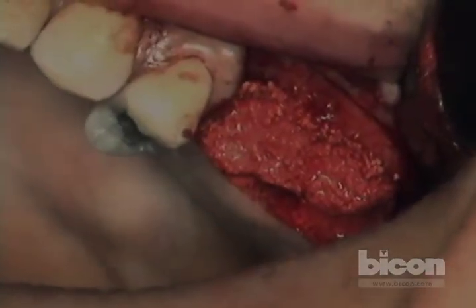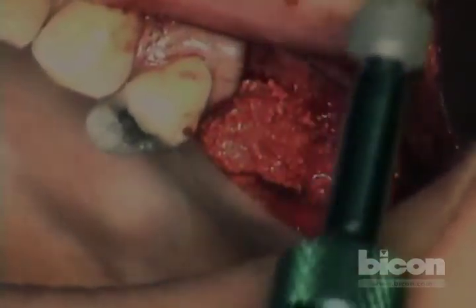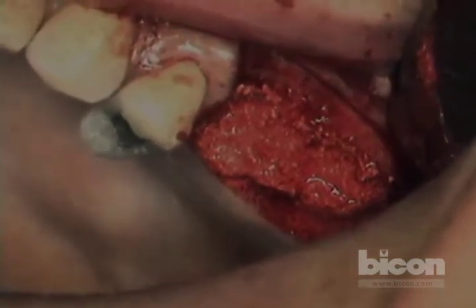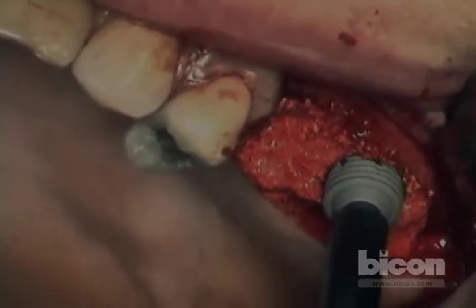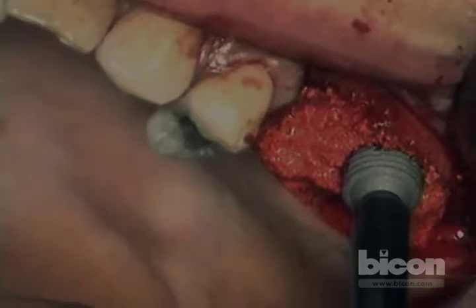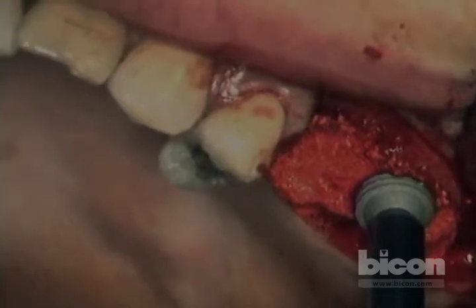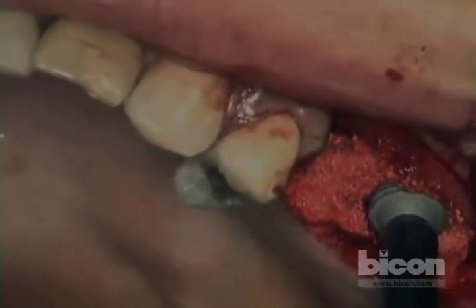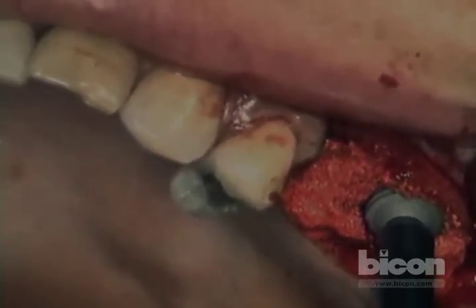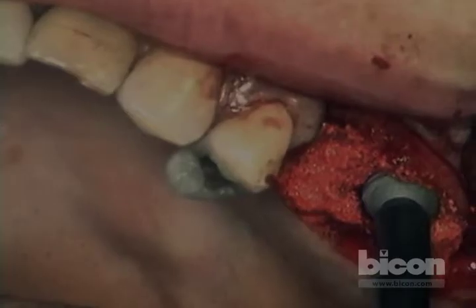I'm going to use an inserter-retriever with a 6 by 5.7 millimeter implant, HA coated. Most often with this technique you will need to go to the very wide implants because that is sometimes what it takes to get to the undisturbed buccal and palatal plates. Although we could force this by hand, it's better to use gentle tapping with the mallet to seat it — this is actually a lot gentler on the tissue and advances more conservatively. I stop about a millimeter short and then watch where you are.